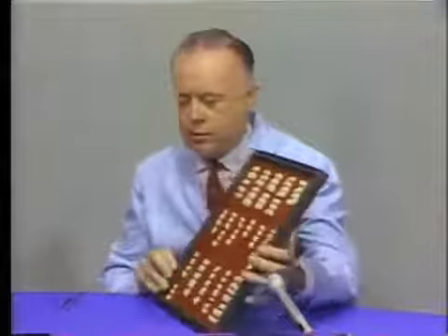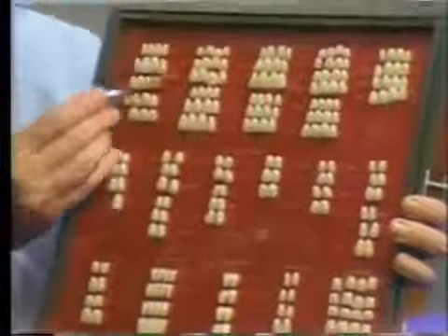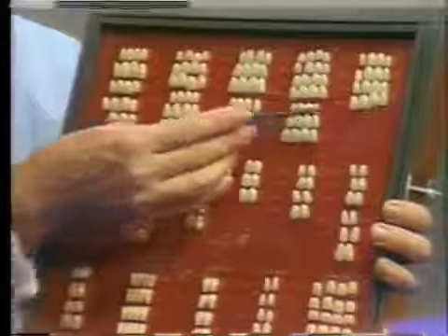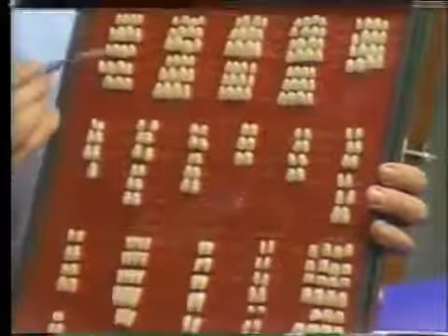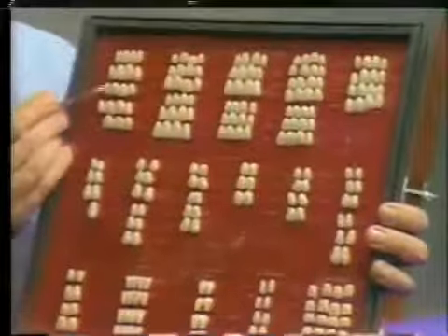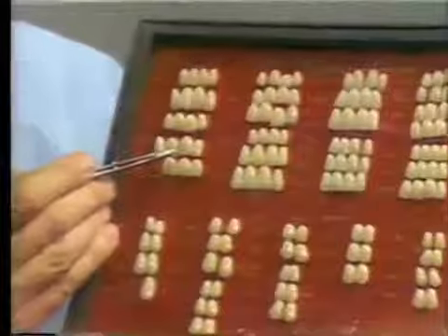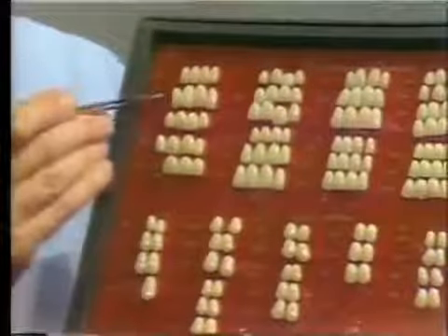In addition to selecting the shade for that particular case, it's necessary to select the correct mold. Now here is a mold guide which shows all the various molds that are available in these long pin facings. You can see up here it starts with various groupings of maxillary incisor teeth. Laterals, centrals, and laterals come in little sets like this. And they're all in different shades, and in different molds and different shapes and different characteristics. Each one of them has an index number here.